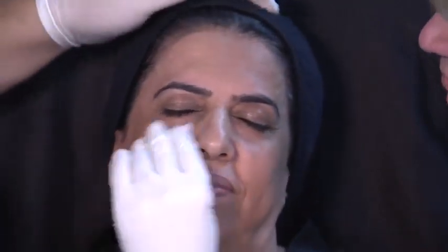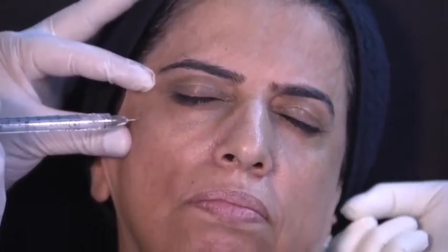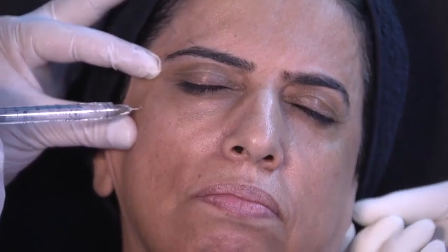If I inject Nasha technology in the zygoma and the zygomatic arch, we're going to improve, but it's going to be visible because the tissue quality above the product is very thin and it's not going to look natural. So this is the reason why my choice of product for the lateral area is going to be defined, OBT. A little bit of tissue integration, but at the same time give support and lifting, okay? Let's go.